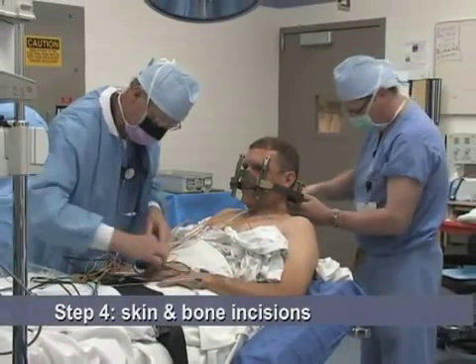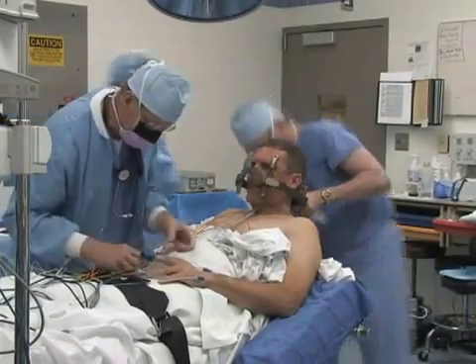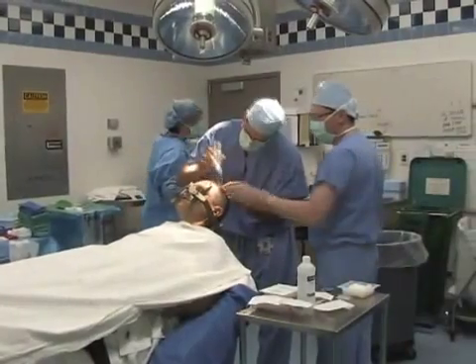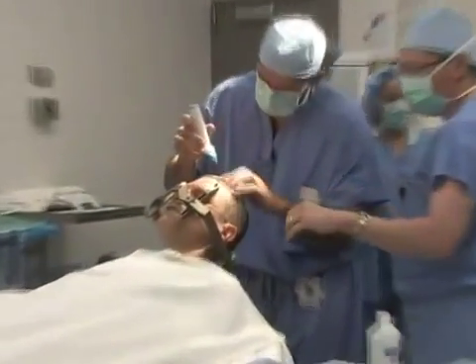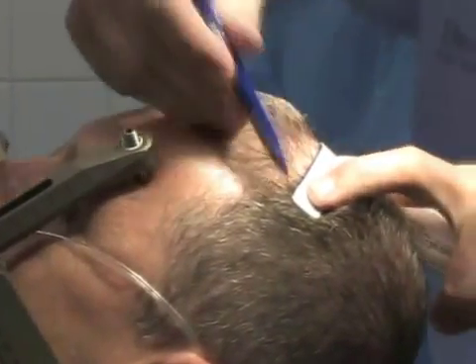Next, you will be taken to the operating room. The anesthesiologist will attach numerous lines and monitoring equipment to your body. The head frame is secured to the table to prevent any small movements of your head during surgery. The hair is shaved about an inch wide along the incision line, and the skin incision is marked across the top of your head.